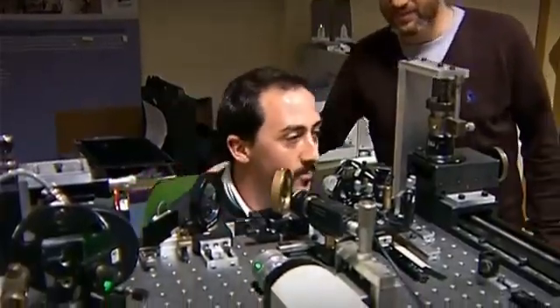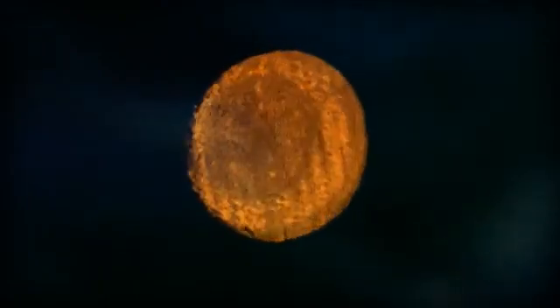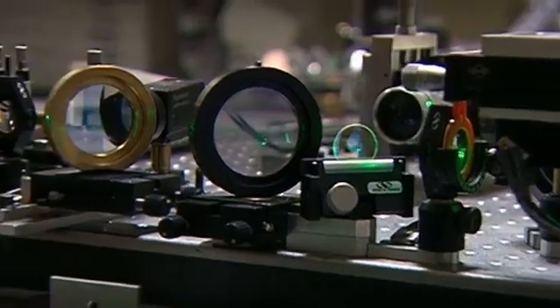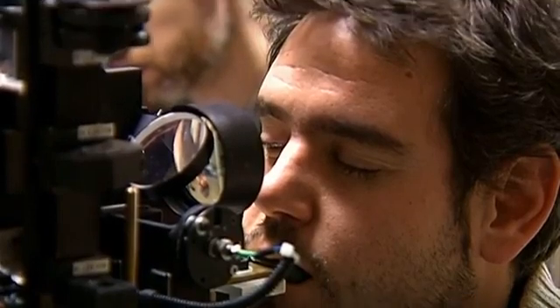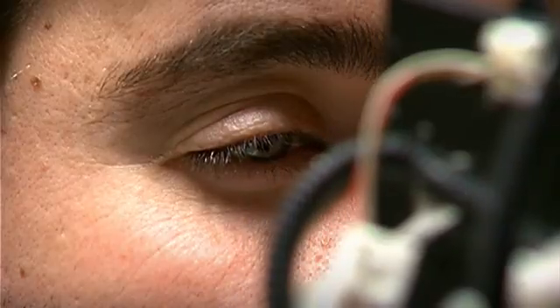The instruments that we have developed in our laboratory range from techniques to measure the optical imperfections of the eye, techniques to measure the geometry of the cornea and the crystalline lens, techniques to understand the optical structures of these ocular components. And also we have developed techniques that aim at comparing visual quality with visual function in the eye. The ultimate aim is to understand visual quality and actually improve vision in the patient. We can provide models that are based on the optics, but also on the biomechanics of the different structures. But of course, we have also tested these instruments in patients.